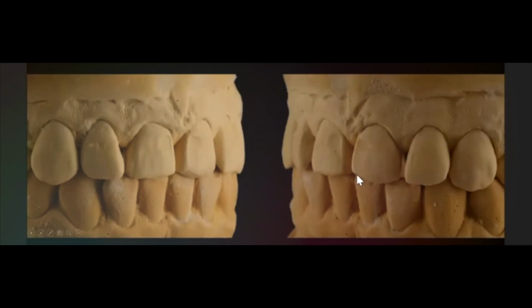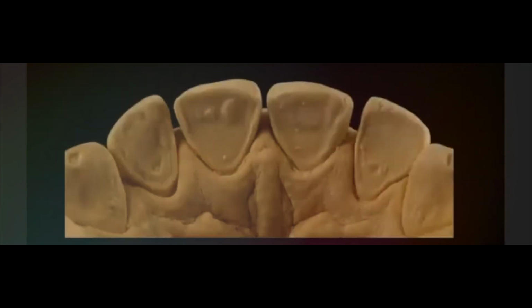an indication for crowns. But because she was young, and because we didn't want to grind her teeth a lot and wanted to keep all the biomechanical properties of her teeth, we decided to make a 2-part restoration. So here you can see the palatal surfaces without any grinding. Hopefully there was enough palatal enamel, especially at the margins, for good cementation, and hopefully enough space with the antagonistic teeth.